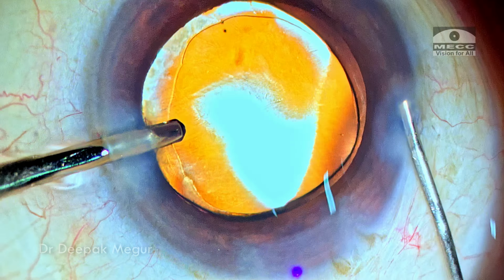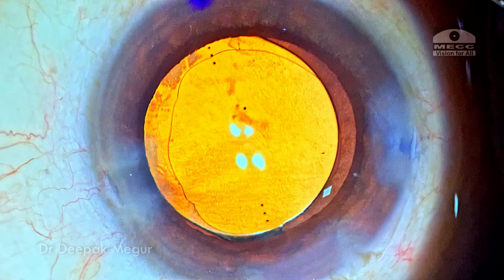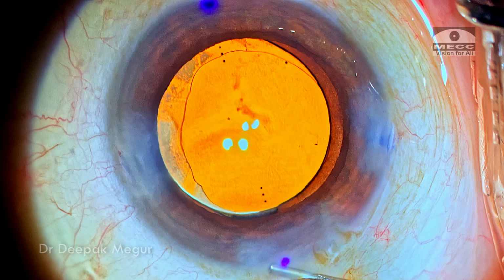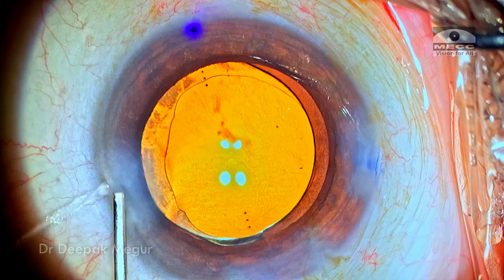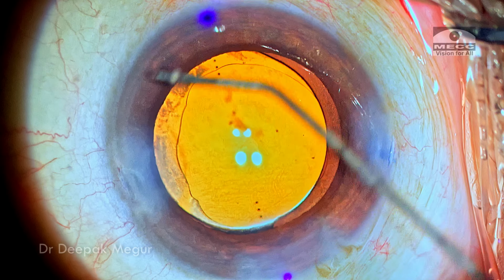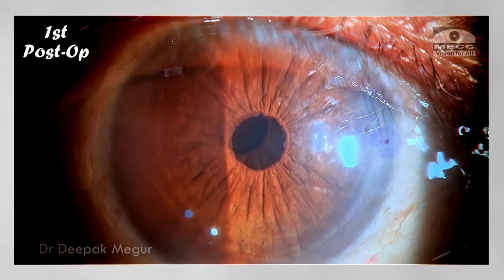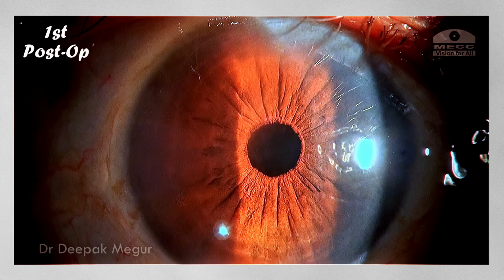Before removing the irrigation handpiece, I'd like to do stromal hydration of the side ports. It is done. And then the main wound, the other side ports are hydrated. I like to keep the eye a little bit soft, not too hard. Lens looks to be well centered, and that's it, the case is done. These are the first day post-op pictures, and the patient is doing pretty fine.